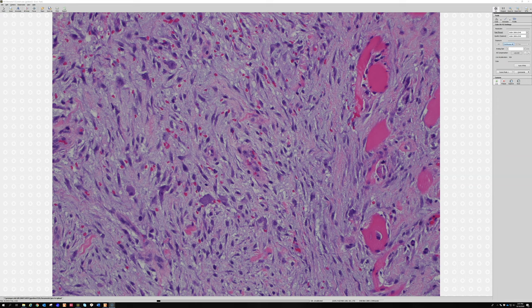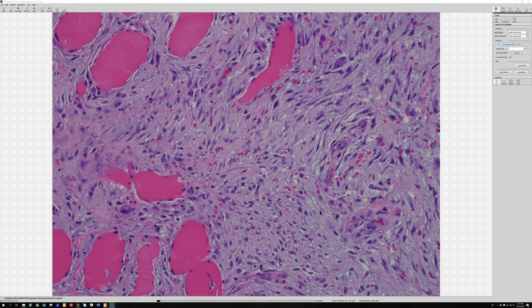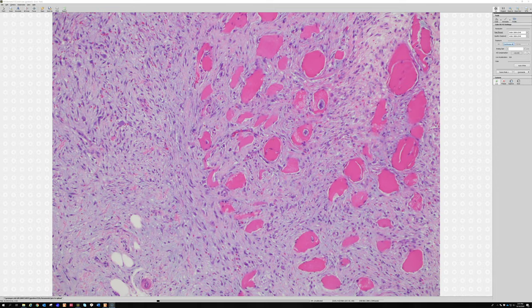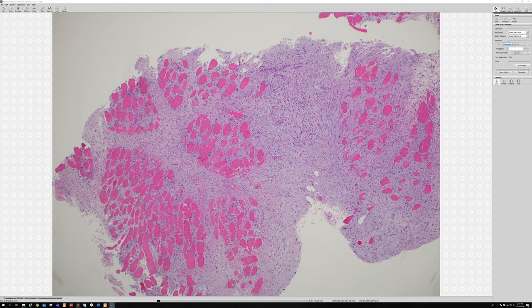This is actually a form of fasciitis called proliferative fasciitis, and it is a very scary-looking process that has caused many people to over-diagnose it as sarcoma. Early in my career I called a case sarcoma that turned out to be a robust case of proliferative fasciitis, where all those big ganglion-like cells — that's what we call those rhabdoid-appearing cells — were packed closely together in the subcutis. The key is that if you ignore the ganglion-like cells, everything else has a fasciitis look: hypocellular, with exceptions.